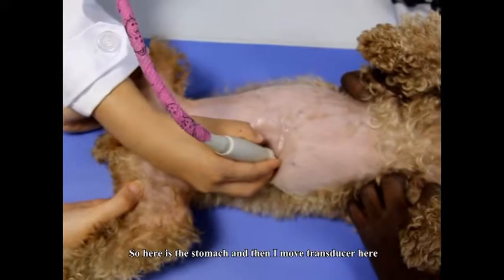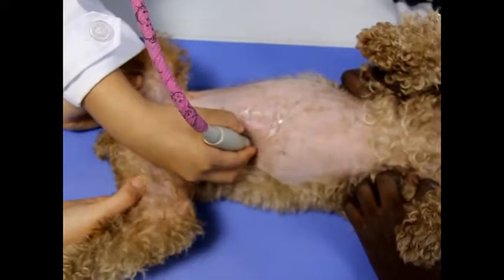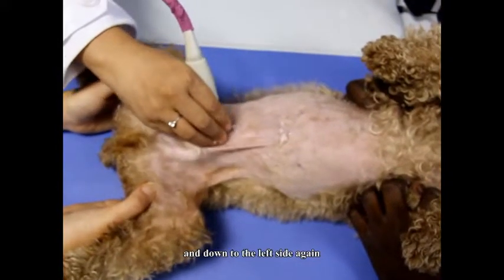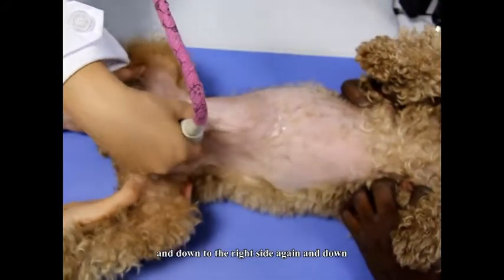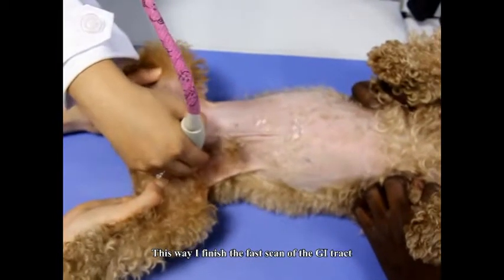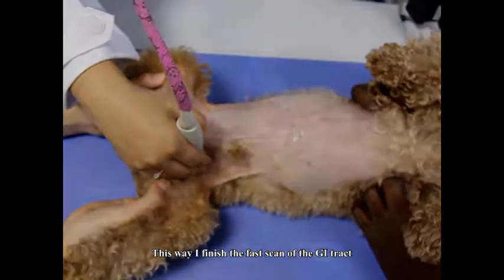So here's the stomach, and then I move the transducer here and move down and to the right side again, and down to the left side again, and go down and to the right side again, and go down. Then in this way, I finish the fast scan of the GI tract.